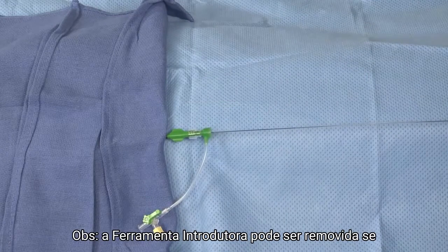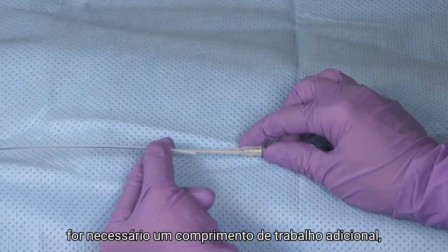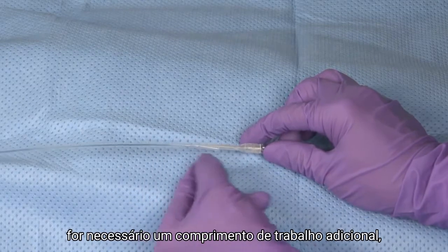The loading tool can be removed if additional working length is needed. Peel off the loading tool as shown.